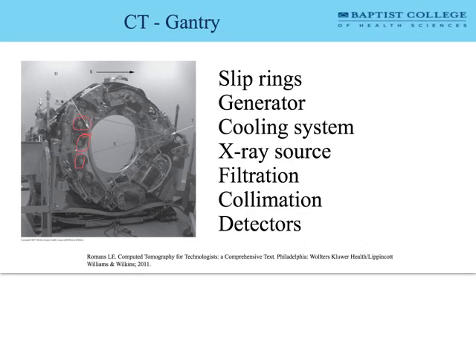The reason I'm talking you through that thinking is because I think it's helpful to understand how we can shape the X-ray beam. That's especially helpful for the therapy students to be thinking about how X-ray beams can be shaped. Not so much maybe for the nuke med people. We still do shaping of the X-ray beam in X-ray, but we do it digitally now. So we'll get into that some more. But the main filter that we might use in CT to shape the beam would be that bow tie filter.